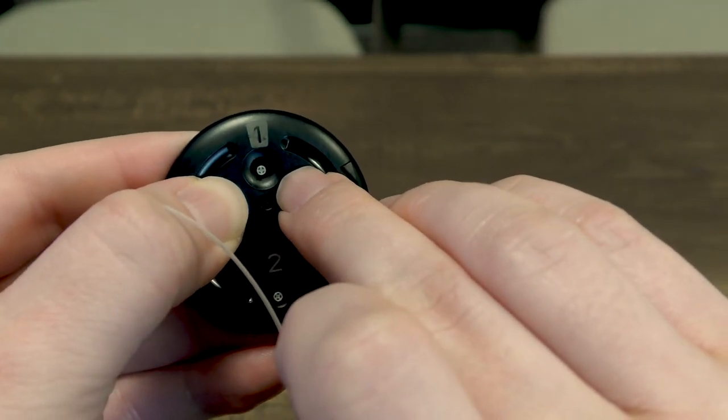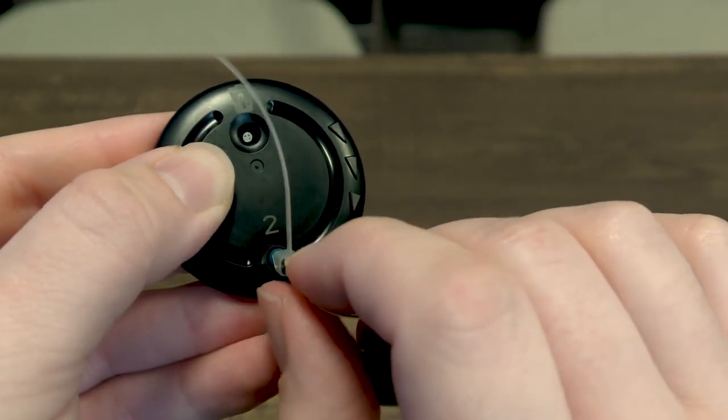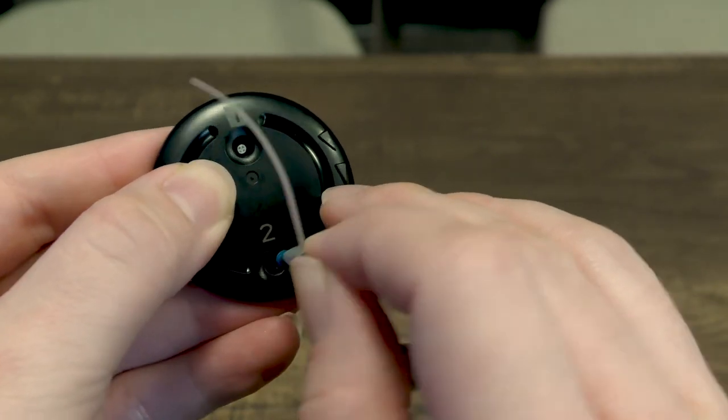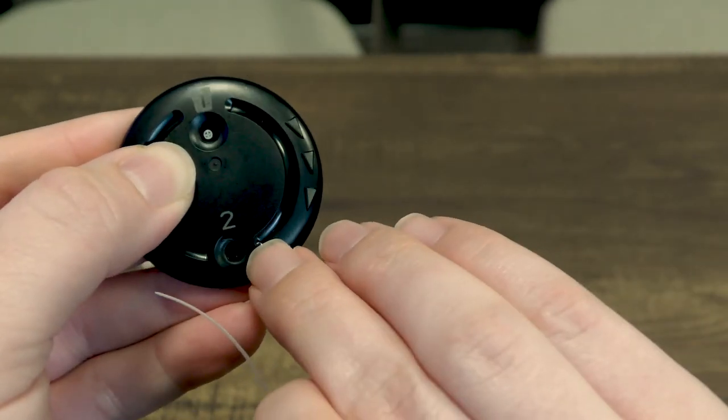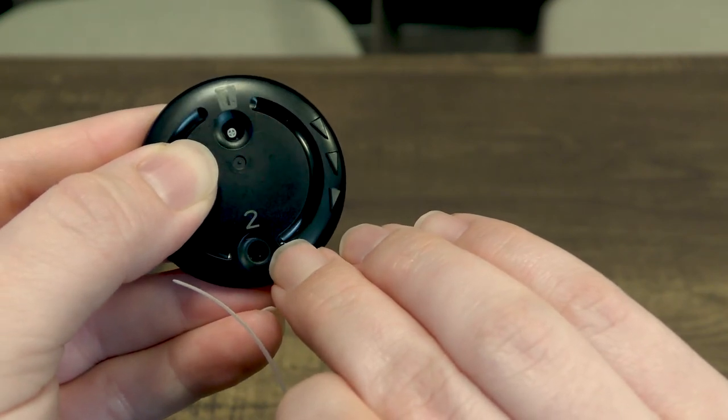Then you just want to place the speaker into the number two spot and you'll feel it click in and then pull it out and now you can see that the new filter is no longer in the number two spot and it is now in the hearing aid.